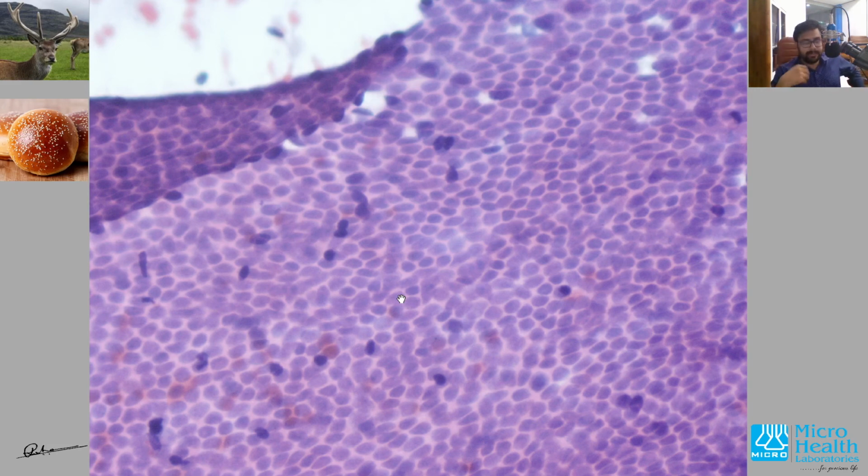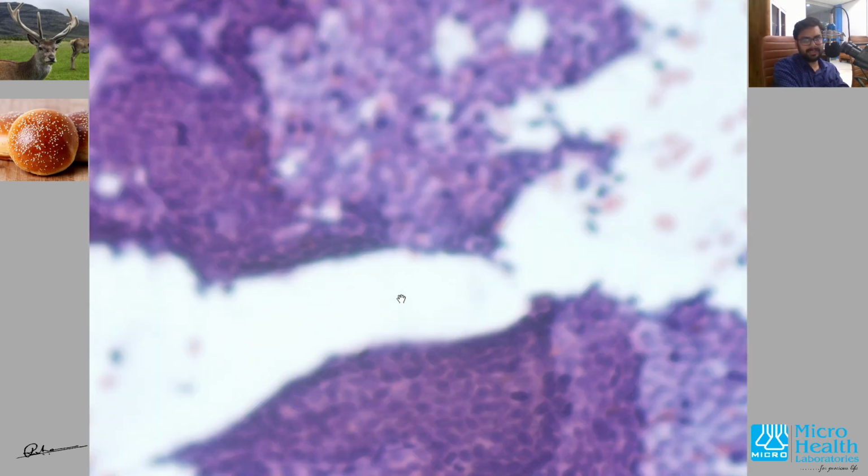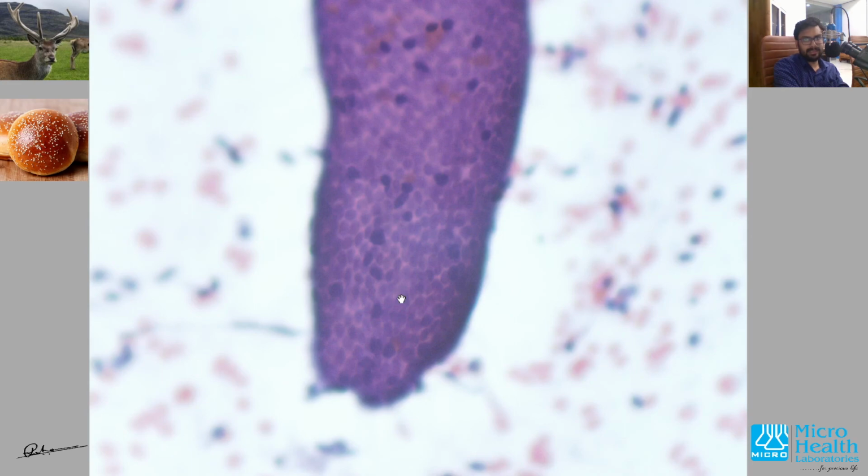So it's a very benign kind of lesion, and some other findings we'll see out of the clusters. We'll just move a little slowly. Moving is very difficult. Focusing is kind of a little difficult, but still, I think it's manageable. A little patience.